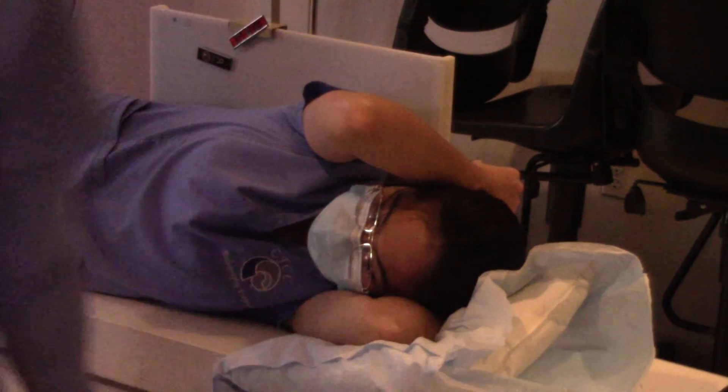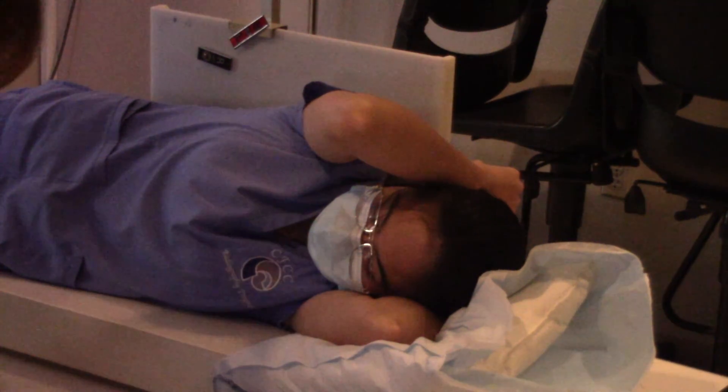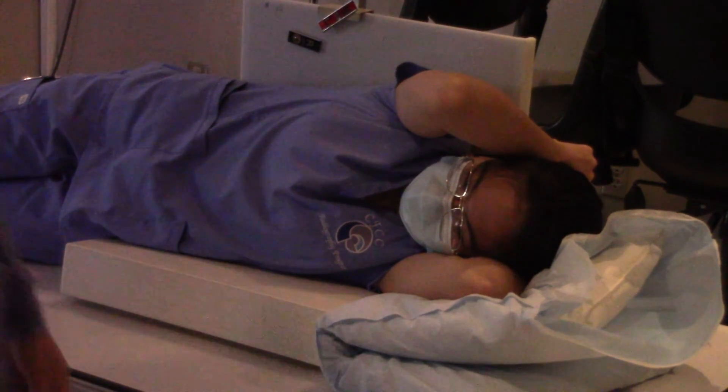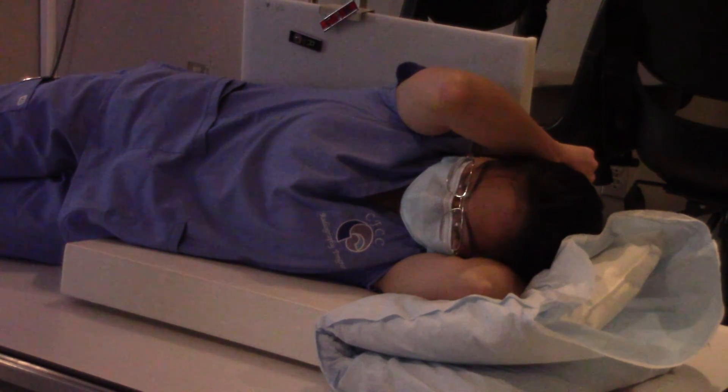Push the table over — that gives you probably another 10 inches or more of SID. You're back as far as you can get and you've got the table pushed over as far as it'll go. So now let's go and revisit our light field one more time. Now we can actually see more of the bottom — that looks a lot better.